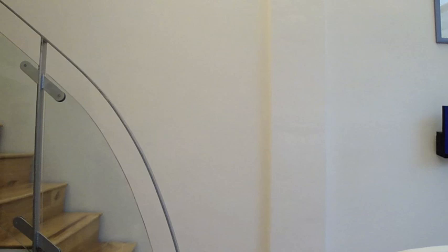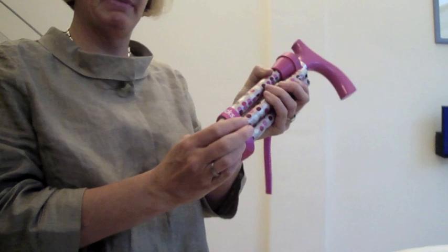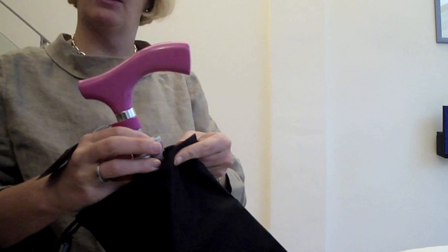To retrieve the Velcro band, you can pop that back on. Because I haven't undone it, it's easy to just pop on. Then the little carry bag, which is also in the box — you can just pop it away into the carry bag and put it in your trunk or wherever.